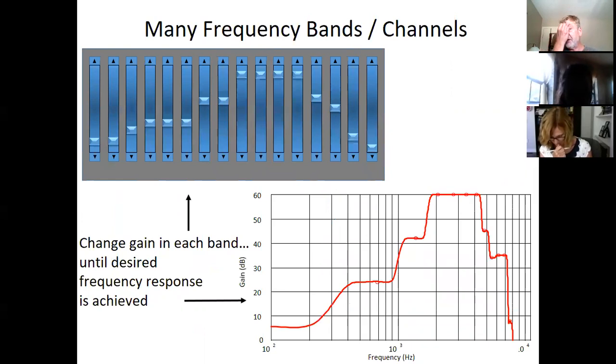Look at this slide here. This is one of our last slides, I believe, of this morning. Yes, it is. Today's digital hearing aids. Look how many channels they'll have. Not 2. You might have 16. You might have 25. And each channel is a skinny little bar.